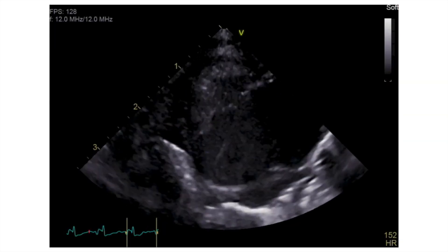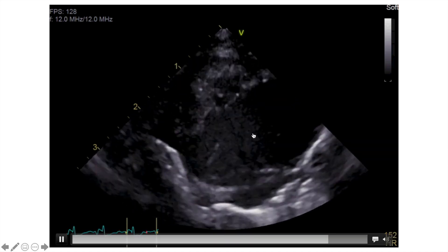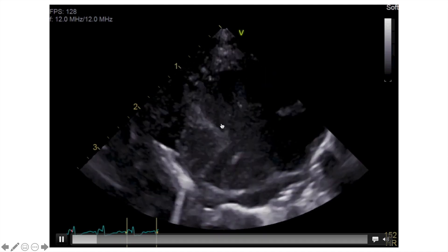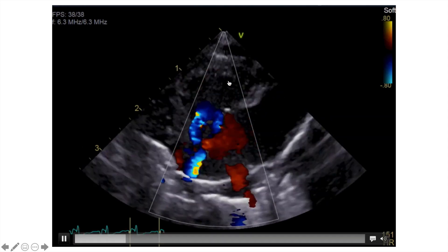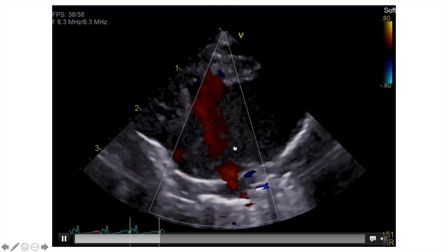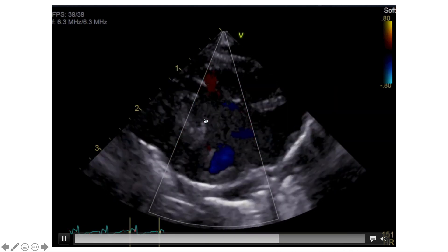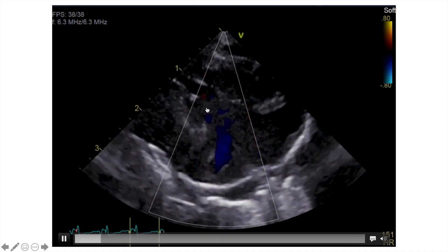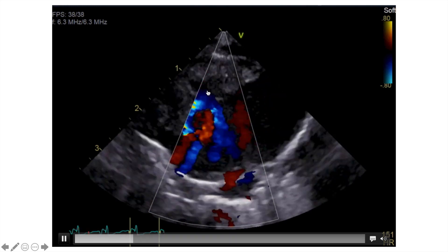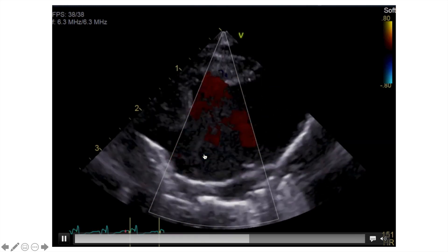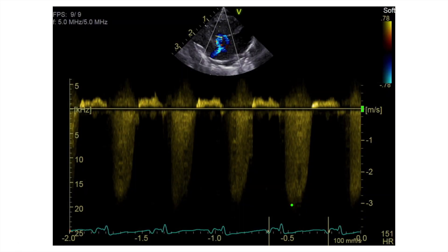This view is the right ventricular inflow. To help you with the anatomy, this is the right ventricle on top and the right atrium with the tricuspid valve in between. When we put the color on, the red blood is normally flowing from the right atrium towards the right ventricle. However, you can see there is blue color blood flowing away from the probe — from the right ventricle towards the right atrium. This is what we call the TR jet.